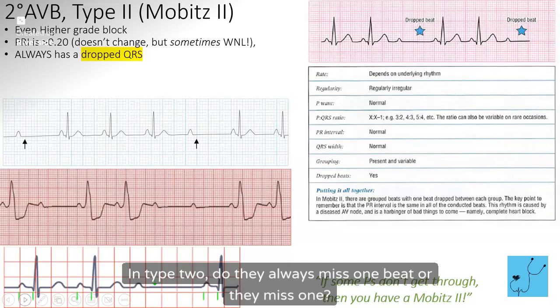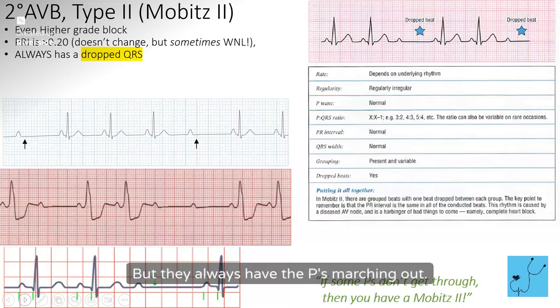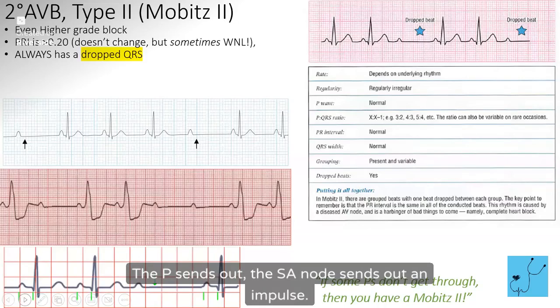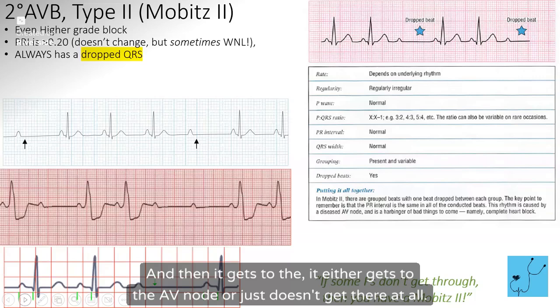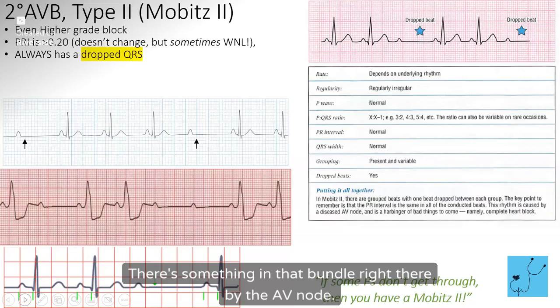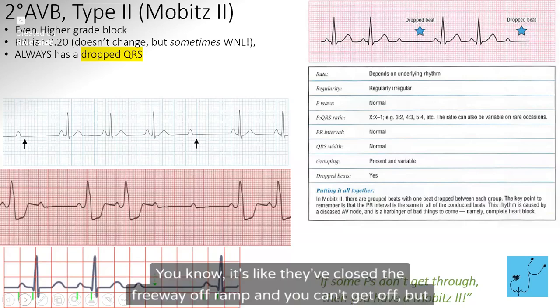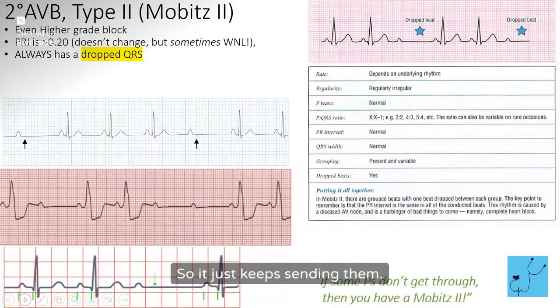In type 2, do they always miss one beat or can they miss more than that? No, like here, there's 2 in a row that they've missed, but they always have the P's marching out. Okay. Because the P is fine. The atria are working fine. The SA node sends out an impulse, and then it either gets to the AV node or just doesn't get there at all. There's something in that bundle right there by the AV node. It just can't get through. It's like they've closed the freeway off ramp and you can't get off, but nobody's told the SA node, so it just keeps sending. So the P's should all march out like it's just a normal day. Okay.